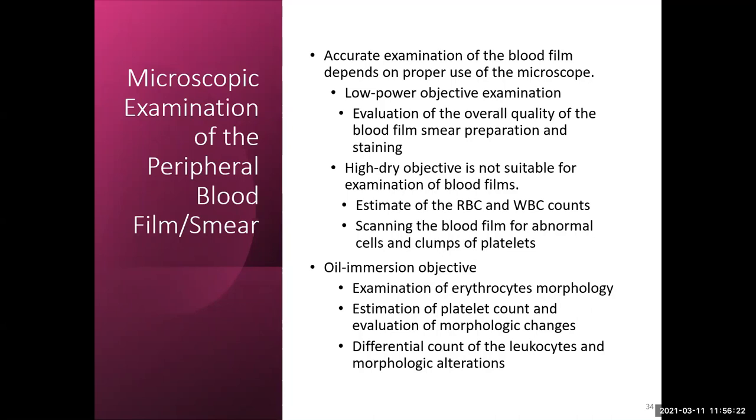For heme one, typically you would have already been in the lab working on some diffs, but I know with COVID things have kind of been shifted a little bit. So you've been doing some diffs online. But if you were working with the microscope in the lab, this is the process you'd go through.